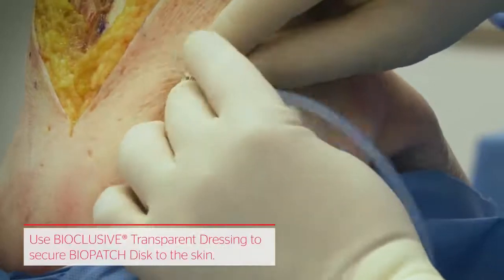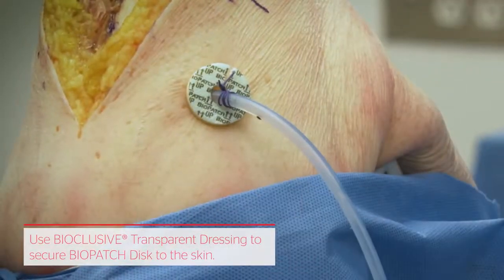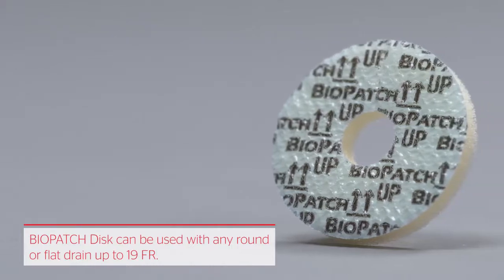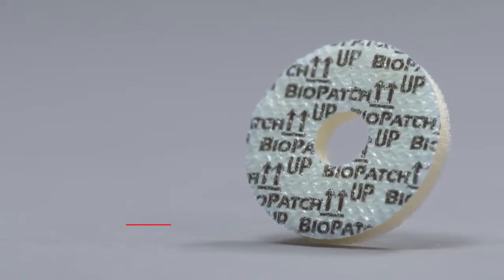Finally, placing Biopatch takes only a few moments and provides 360-degree antimicrobial coverage around the drain, giving surgeons added confidence that the drain site is protected.